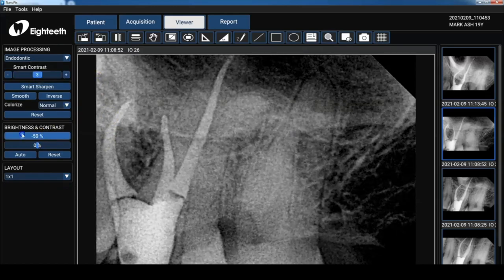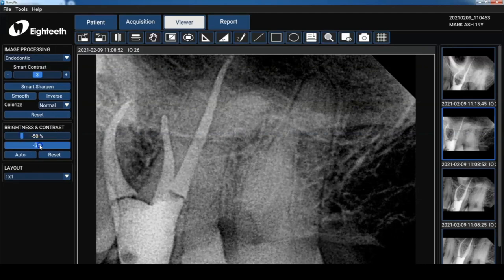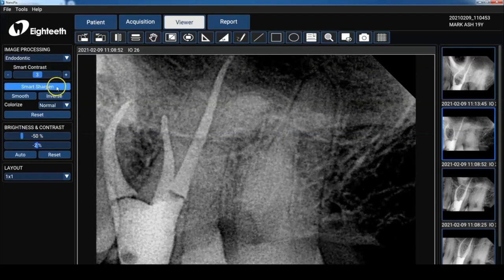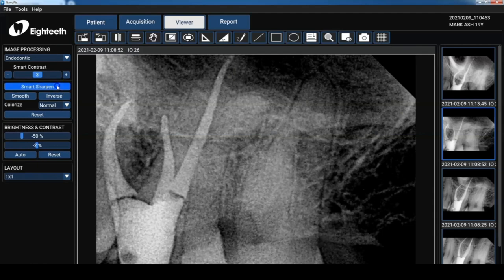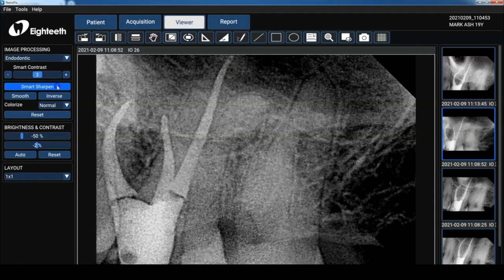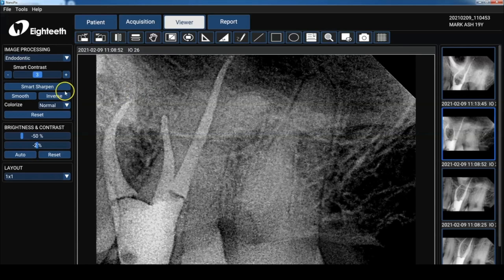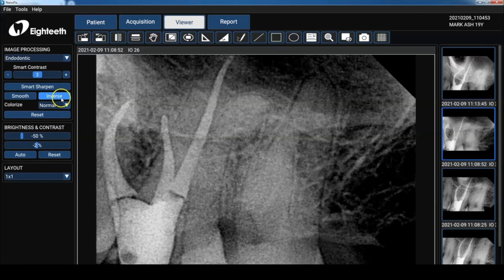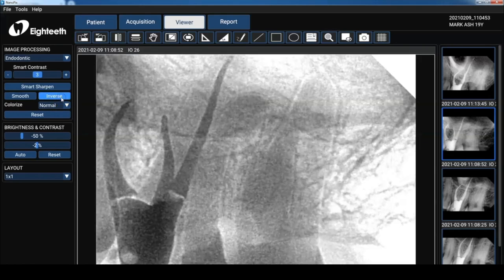Now I haven't really gotten used to using the smart contrast, but I can tell you the smart sharpen, I love it. As you press it, it increases the sharpness of the image. And for you Facebook posters, you can use your inverse as well to post on Facebook. I'm just kidding.